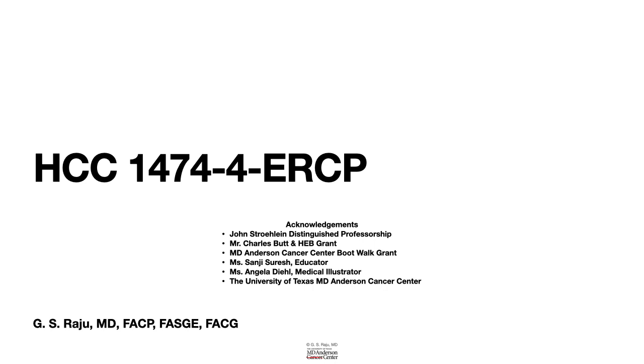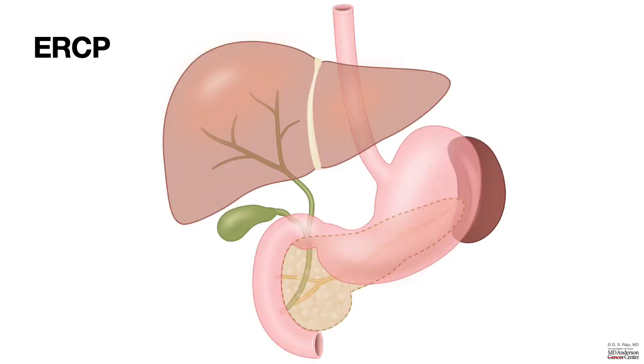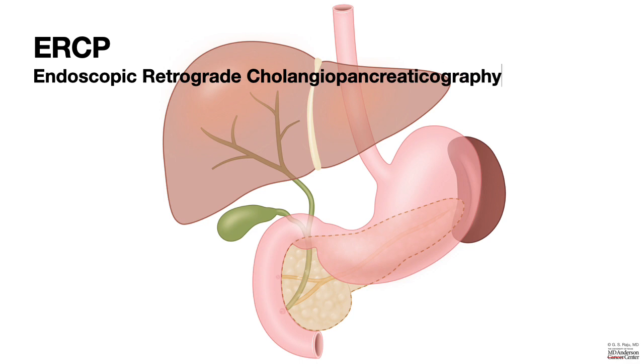ERCP. What is ERCP? Endoscopic retrograde cholangiopancreatography. And this is used to evaluate the bile duct and the pancreatic duct.